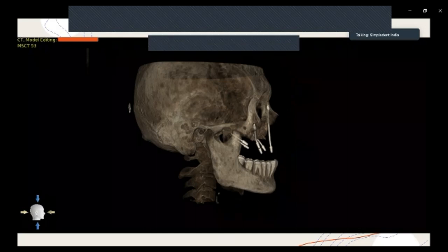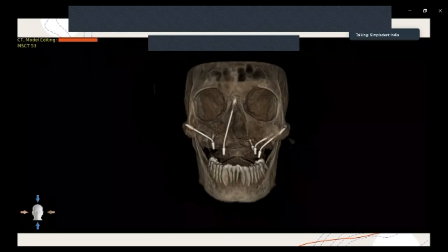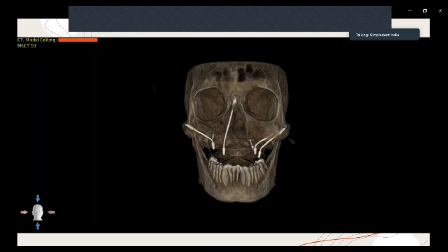As you notice, my glabella implant is coming more towards the right hand side. Why is the emergence there? Because I remember that the quality of the bone was very low on the right hand side of the zygomatic bone. So I placed my implant from the right hand side so that I am good. Because there is only one zygoma implant available on the right hand side, with very poorly mineralized bone, I want to minimize the pontic span in that area.